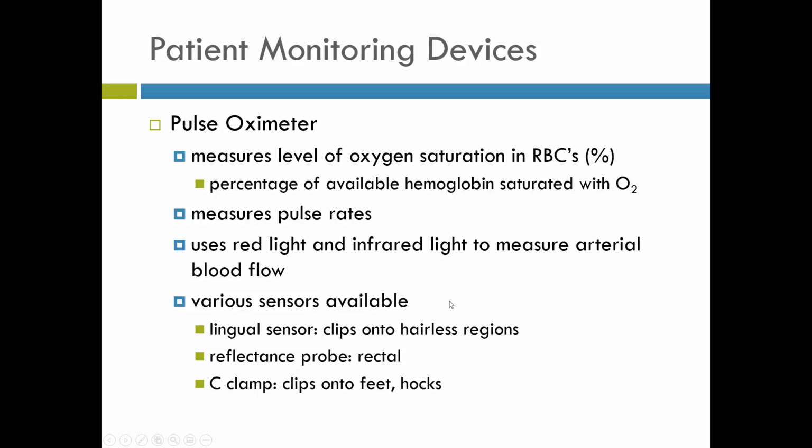There are various sensors available: the lingual sensor, the reflectance probe, and the C-clamp. So make sure you do know where these all attach. For the most part, we do stick them on the tongue. Sometimes we'll stick it up the bum.